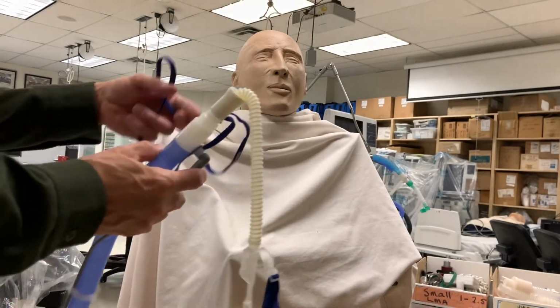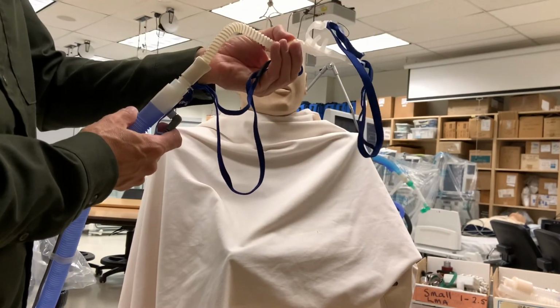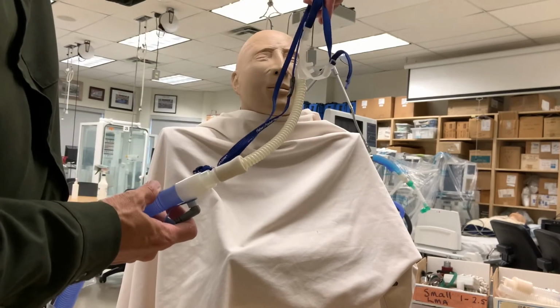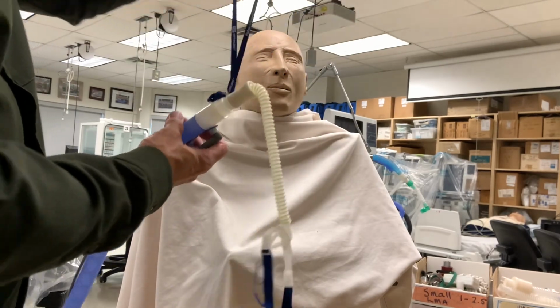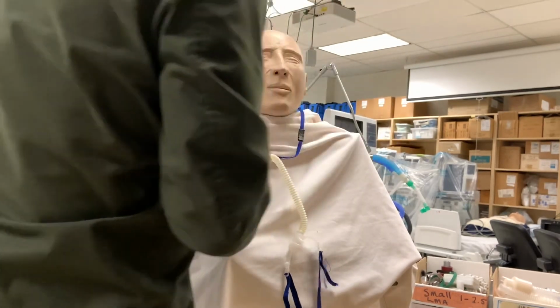Here I'm going to apply the high flow nasal cannula to the mannequin. There are two straps on this device. One goes around the patient's neck and the other one goes around the patient's head. The first one that goes around the neck is just to help support the weight of this device and keep it off of the patient's face.